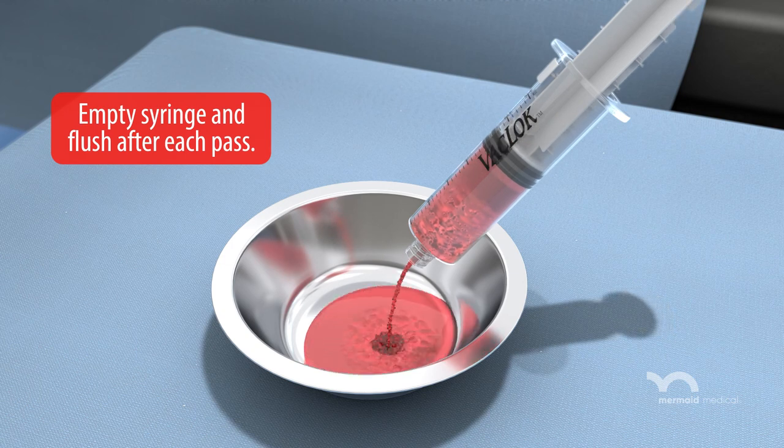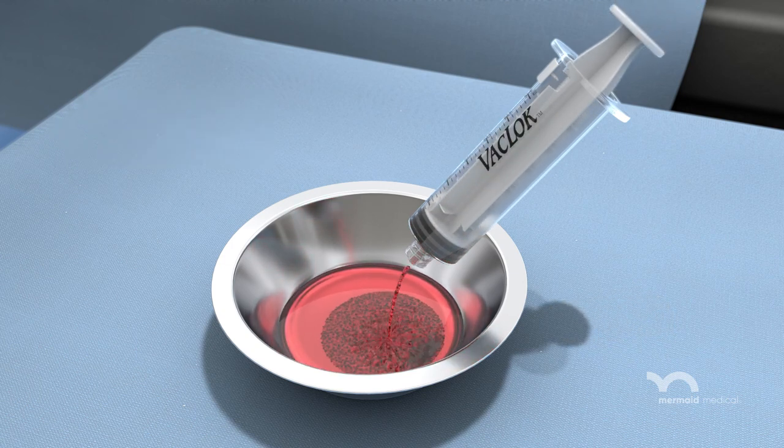Empty the syringe and flush the system after each pass and reactivate the locking syringe.